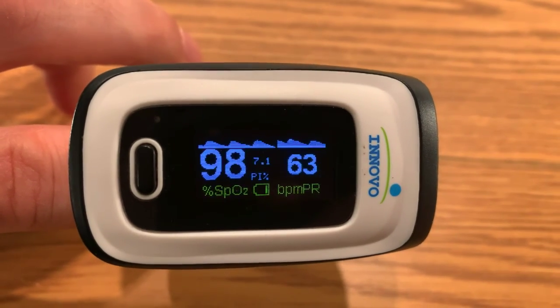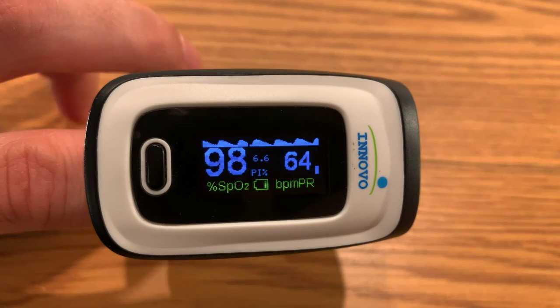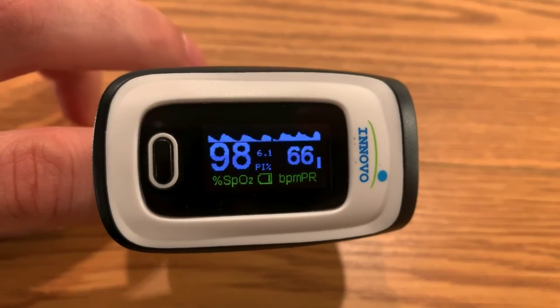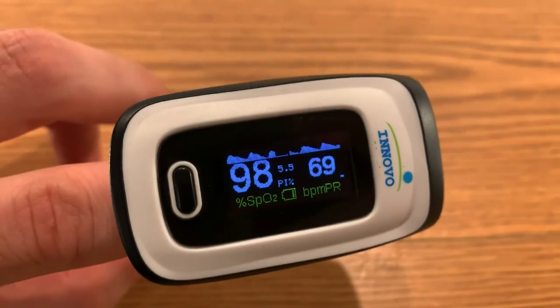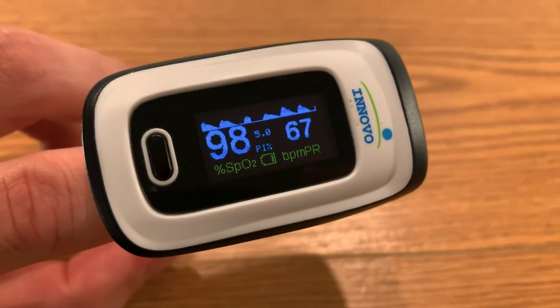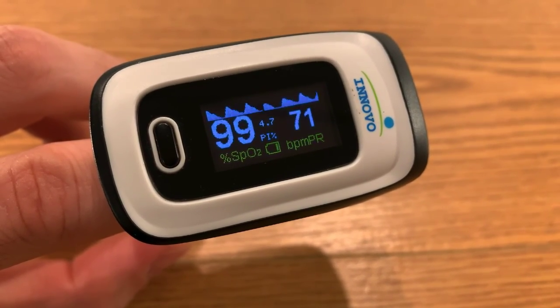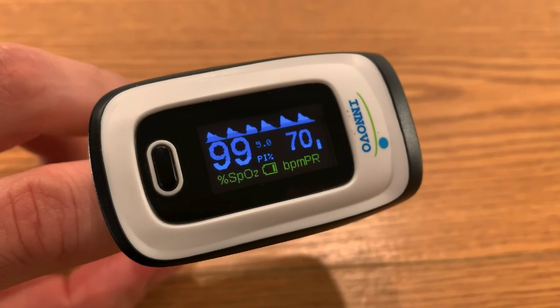Right now my heart rate is 63 beats per minute. The 98 reading — I honestly don't know what that is. But it's pretty cool because doing this I got more in tune with my body. I can really sense my pulse very easily now without this device.